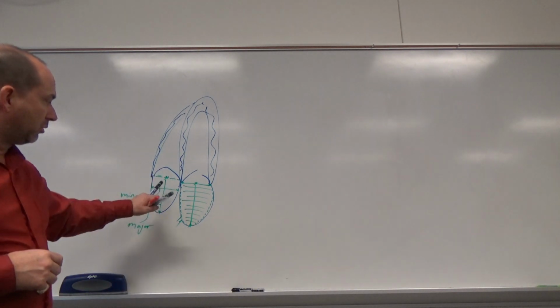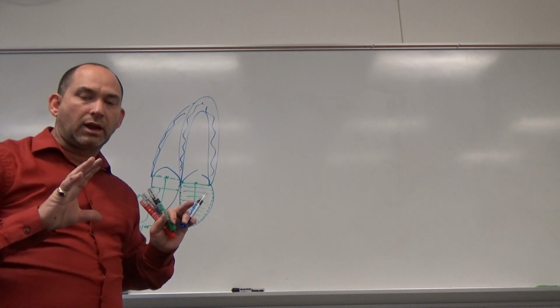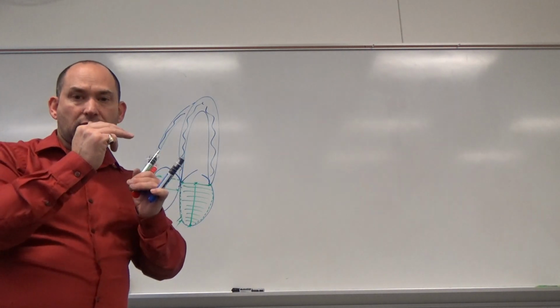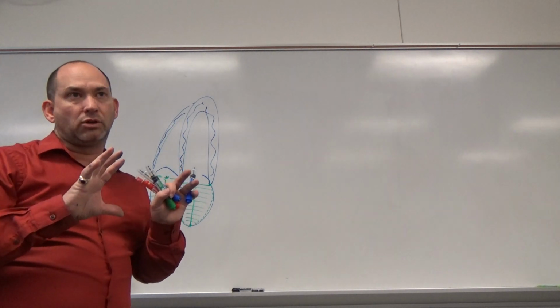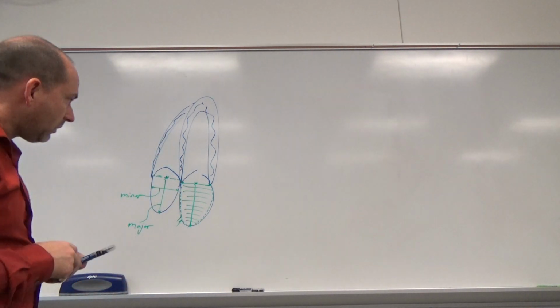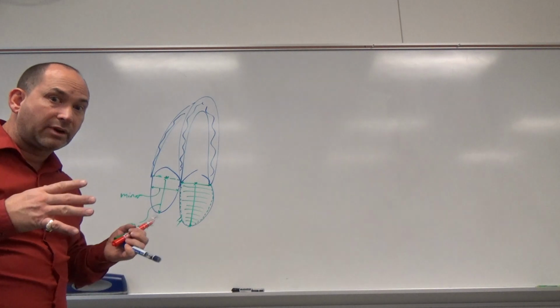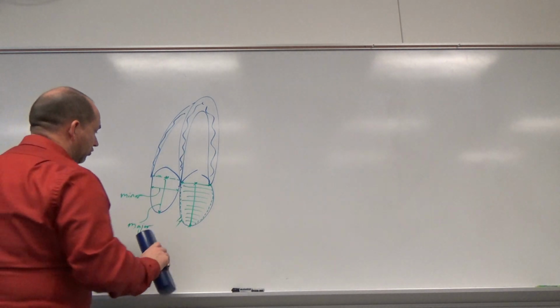That's really all we do, but we visually compare the size of the left and right atria to see that they're both open as much as they can be. The right is usually slightly shorter but wider than the left atria, and both of the atria are about 1/3 of the size of the ventricles that they're related to. So symmetrically speaking, they should be like that. If the atria are now the size of the ventricles, then you probably have something going on. So that's atrial measurements.